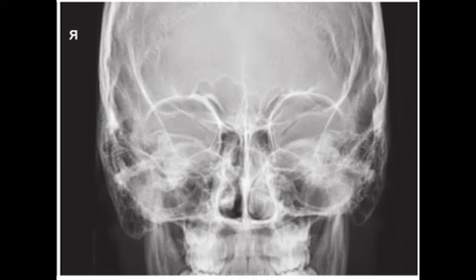Just to start off as a blanket statement for all of the sinuses, you want to have your patient seated or standing upright, but they must be vertical in order to take an accurate assessment of air and fluid levels within the sinuses.